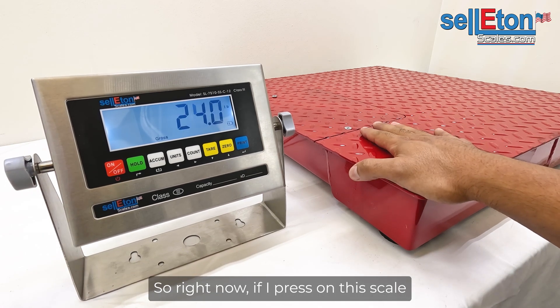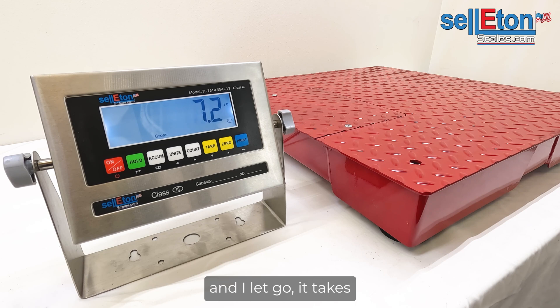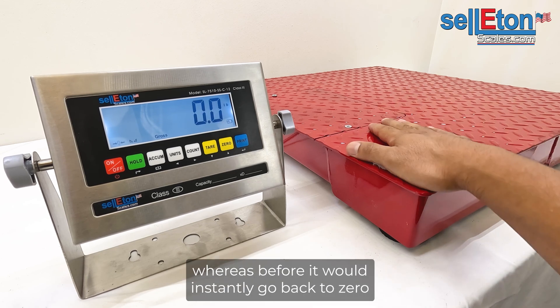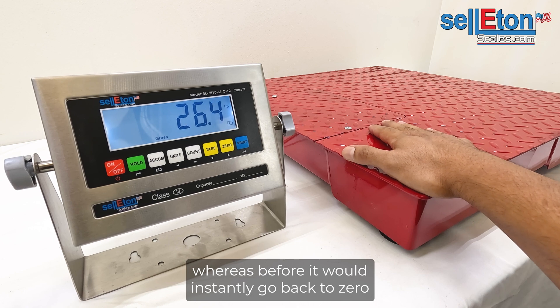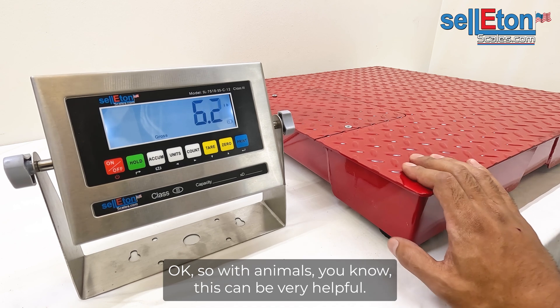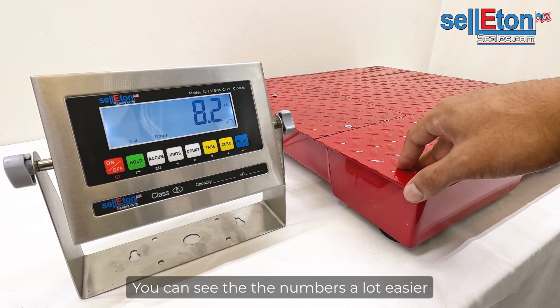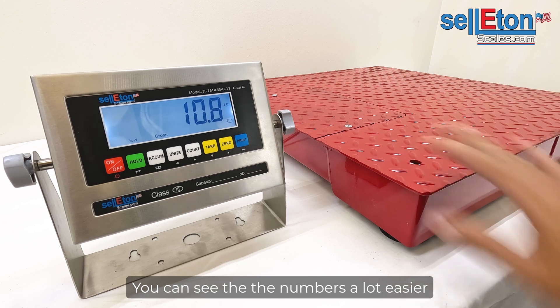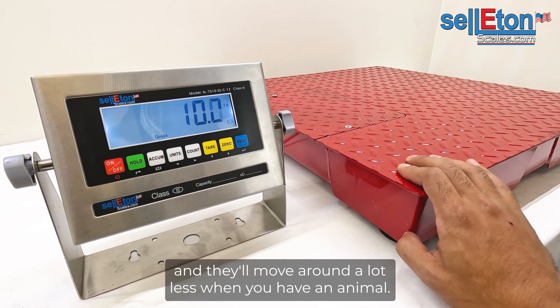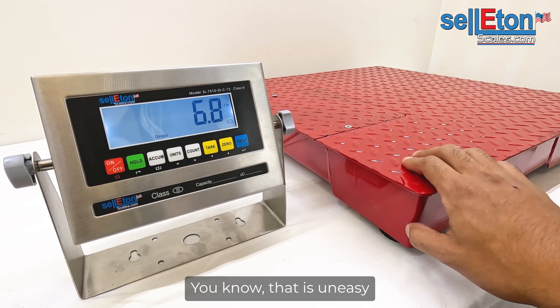So right now, if I press on the scale and let go, it takes a couple of seconds to get all the way back to zero, whereas before it would instantly go back to zero. With animals, this can be very helpful — you can see the numbers a lot easier and they'll move around a lot less when you have an animal that is uneasy.